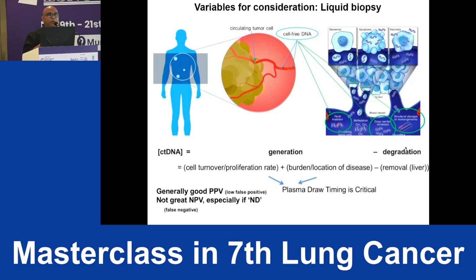So you may get a report in your office that is negative, but that may not be reflective of the tumor or of your assessment of the patient's underlying disease. To minimize that, we have to understand what underlies it, and that's something I wanted to emphasize.